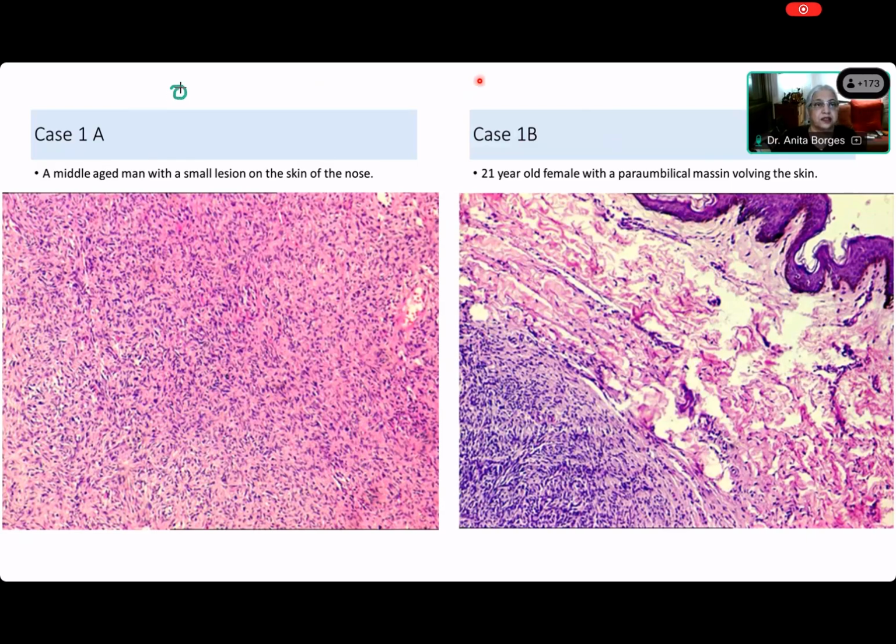You know what is concentric? Concentric is this: there's something that goes completely round, then the next layer goes completely round, then the next layer goes completely round. So if you tell me this looks like that, then I will agree that it is concentric. Is it concentric? No, ma'am. Very good.